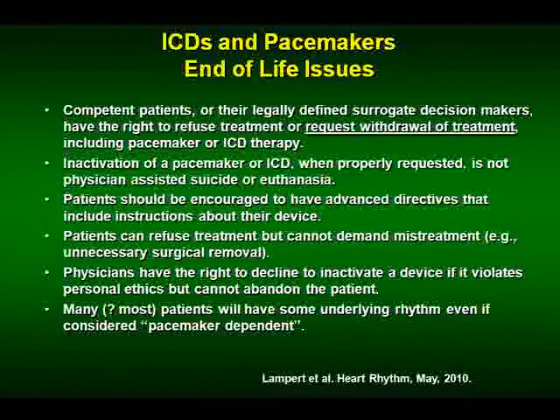Well, the problem is, a lot of times, even though we say the patient is pacer dependent, there's some underlying rhythm, and it still may take the patient days to die, so you really have to be careful about that. I usually tell people having the pacemaker on makes their patient easier to manage. Eventually, the pacemaker will just stop capturing.